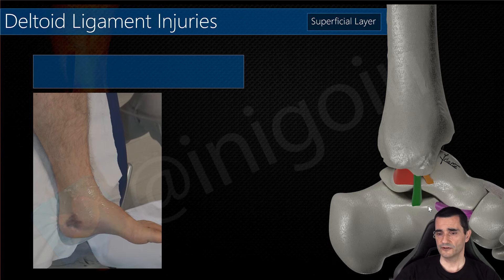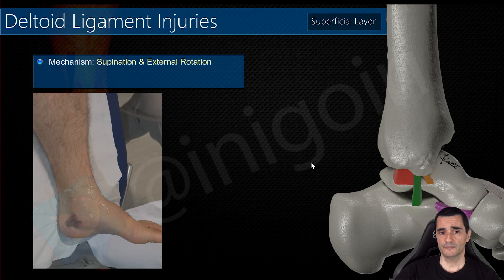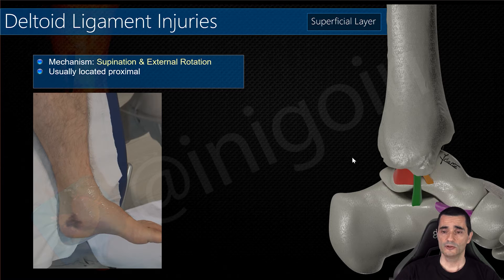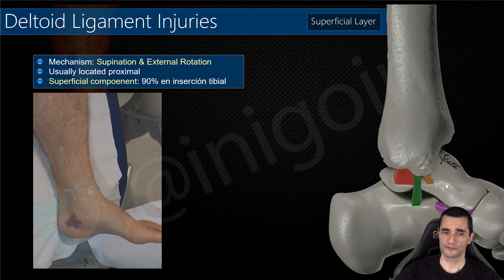In the superficial layer, we begin with the tibio-calcaneal ligament, which runs between the tibia and the sustentaculum tali. This superficial layer is usually affected in a mechanism of supination and external rotation. The injury location is usually proximal — 90% of affections of the superficial layer take place at its tibial insertion, so always check this area.